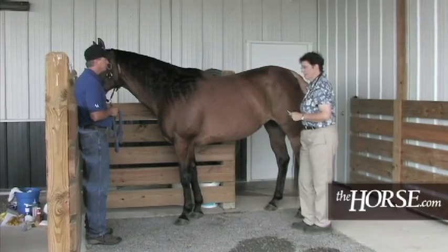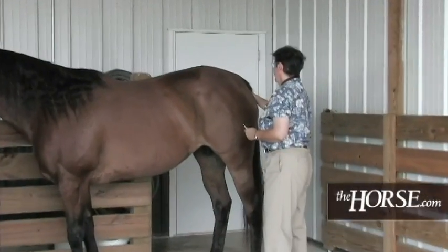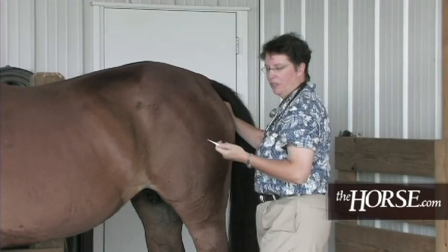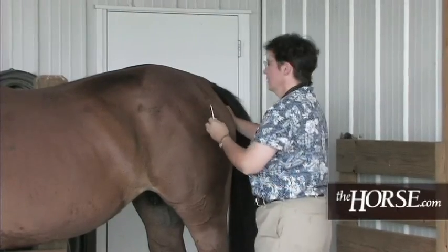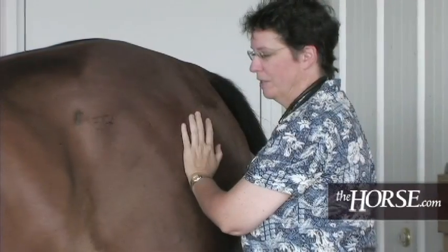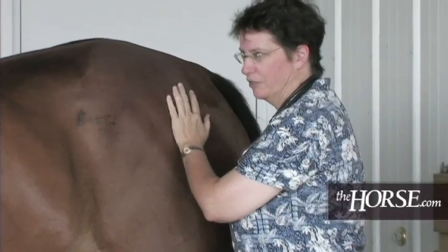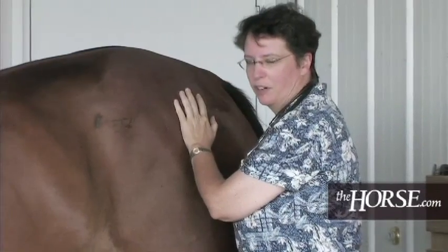With a calm horse that's used to having people working around its tail, just reach underneath — sometimes they'll actually lift their tail for you. Lubricate the tip of the thermometer with a little bit of Vaseline or some other non-toxic substance to ease insertion, then wait until the little beep goes off. Always stand close to the hind end of the animal, so if she decides to kick at a fly you won't receive the full brunt of the kick.